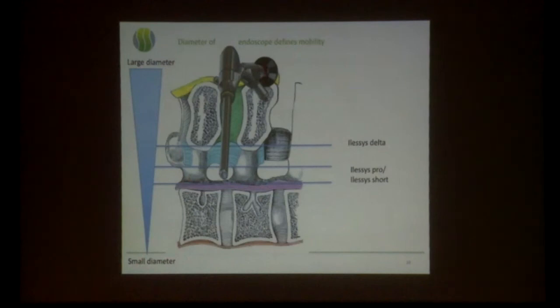You have to mount a table, and then your hands are only free. And then you can see only under the microscope through the tubes. With this endoscope, the advantage is you hold it in the hand and you move. So wherever you want to go, you can move it. And as you said, the suction pumps are available. It's constantly suctioning and providing the water.